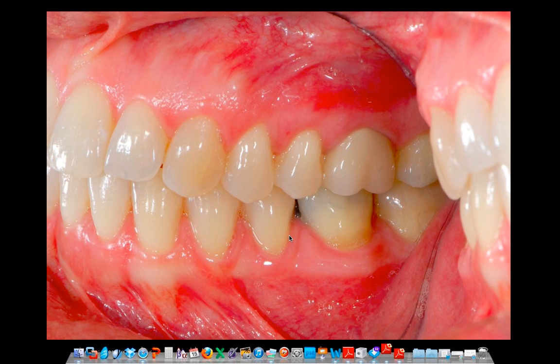Here's one where we have the same teeth blocking the second molar. My Angle's classification is not appropriate. Look how we're looking pretty much straight on at the cuspid, right? We're not really looking straight on at the second molar and the way it interdigitates with the lower second molar. We're looking straight on at the cuspid, bicuspid region.